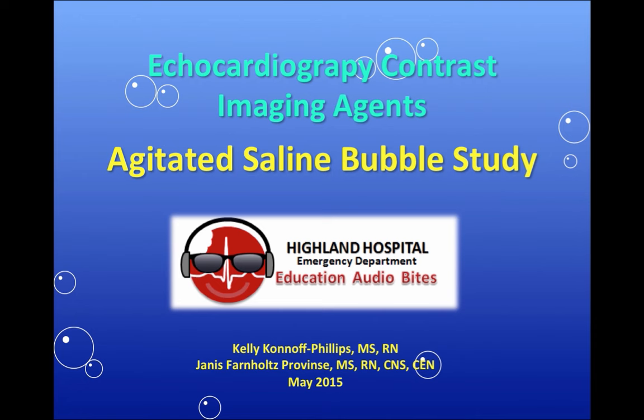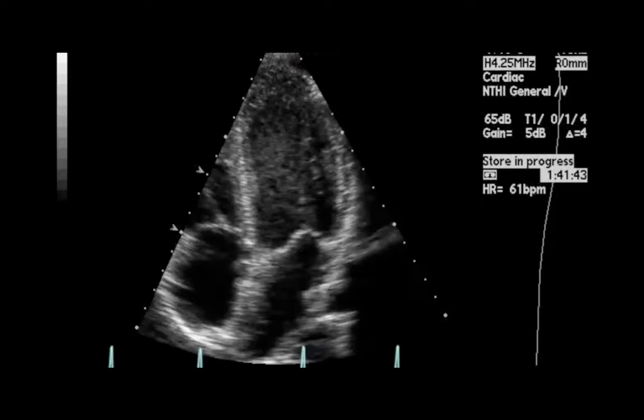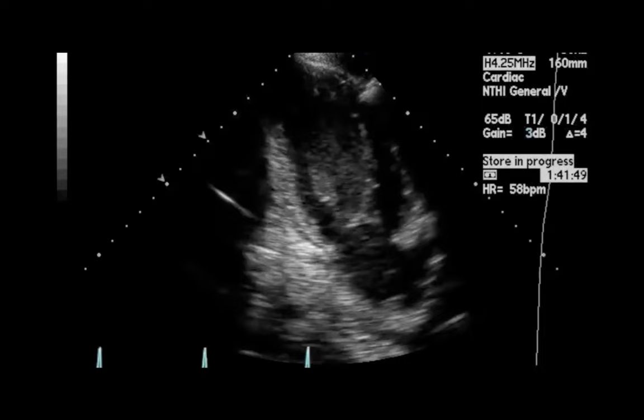The following video is an echocardiogram of a heart without contrast. If you notice, the heart is upside down and flipped with the atria on the bottom of the screen and the ventricles on top. Also, the left side of the heart is on the right hand side of the screen and vice versa.